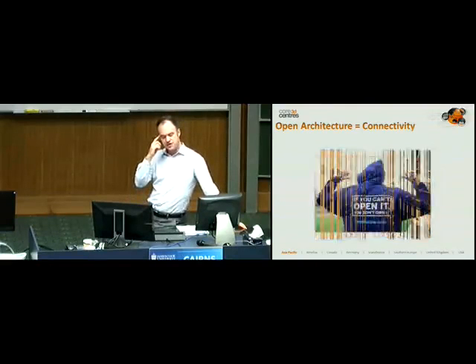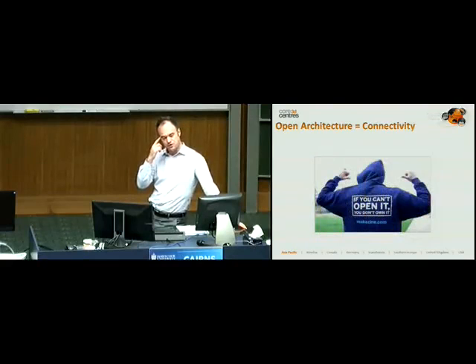That obviously makes a lot of people frustrated, especially some of the IT geeks who are used to cross-platform compatibility. It's the same in the dental world. You want to be able to have a system that is effectively open. You can access the file and use it in different systems and different software packages. So you'll hear me talk about open architecture, and I think that equals connectivity, and it helps you future-proof your purchase. So just something to think about is if you can't open it, maybe you don't own it.